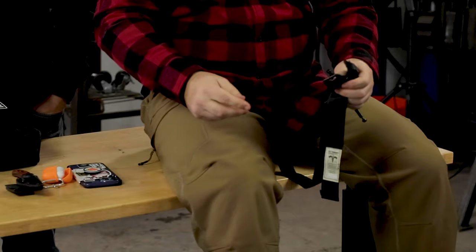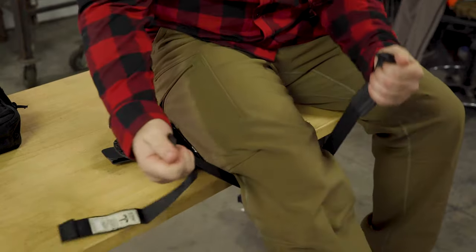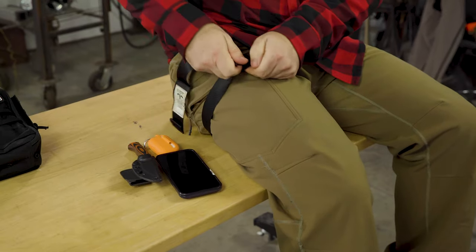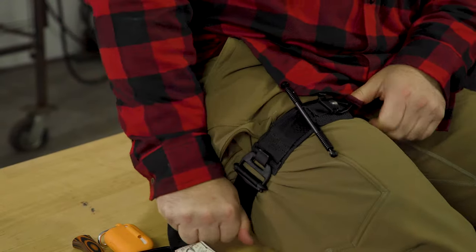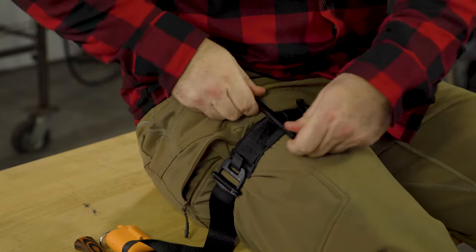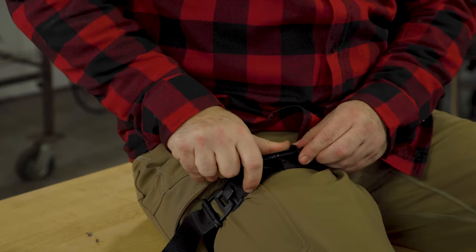If we're laying flat on the ground or in a chair or anything else, we have a natural arch behind our knee. We're going to use that space to slip the tourniquet underneath our leg, and then we're just going to seesaw it above the wound. Buckle and take out the slack. From there, pull up on the windlass and start twisting. You can tell it's working because my leg is starting to raise.